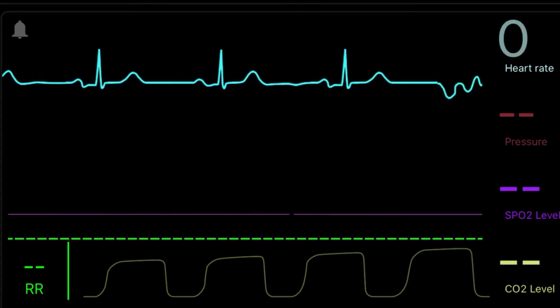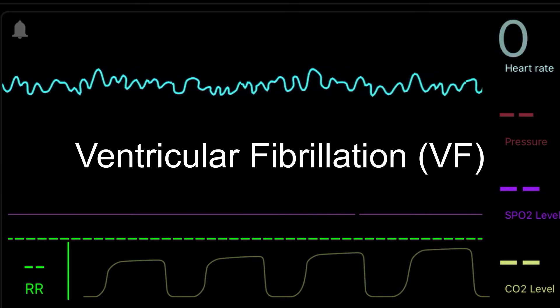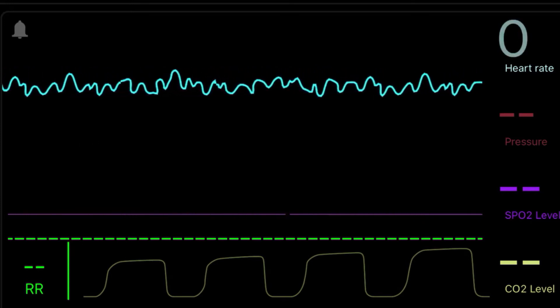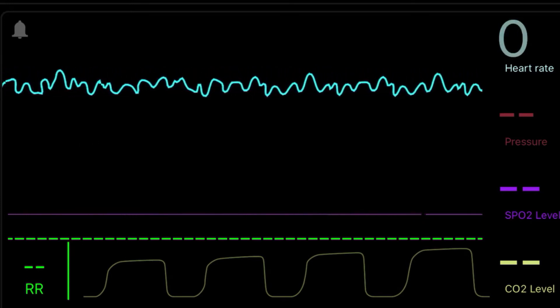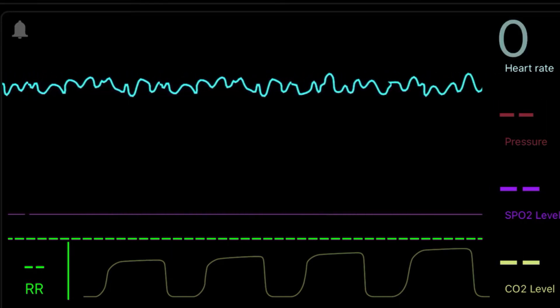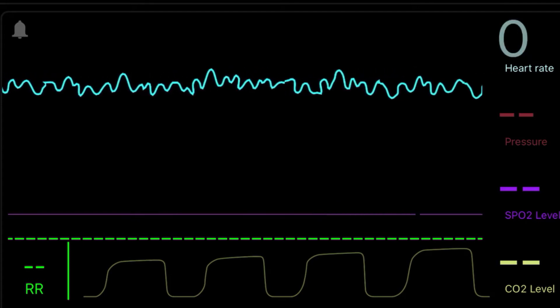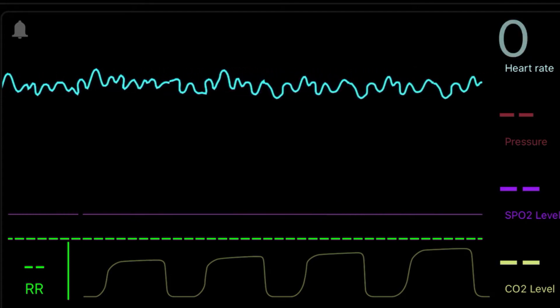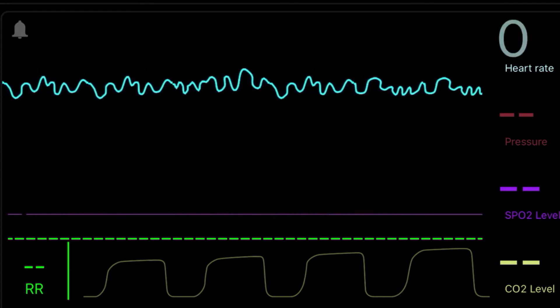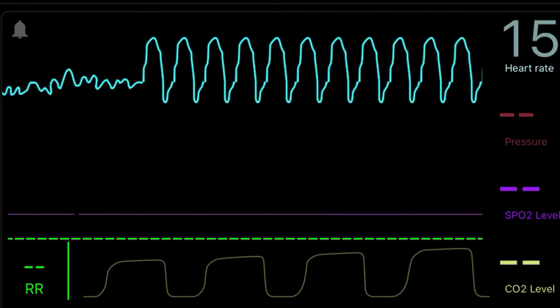This is ventricular fibrillation, which is very chaotic. You can look at this rhythm and see there's nothing organized about it. This is the rhythm the heart is in when we use an AED. A patient should be apneic and pulseless with this rhythm — it's just spots in the ventricles all trying to fire at once. The AED will then shock that rhythm and hopefully return it to a normal beat.